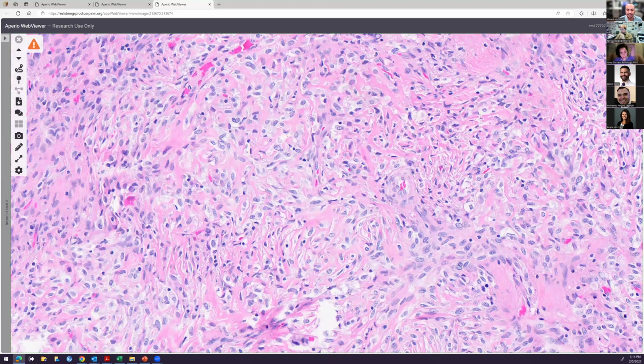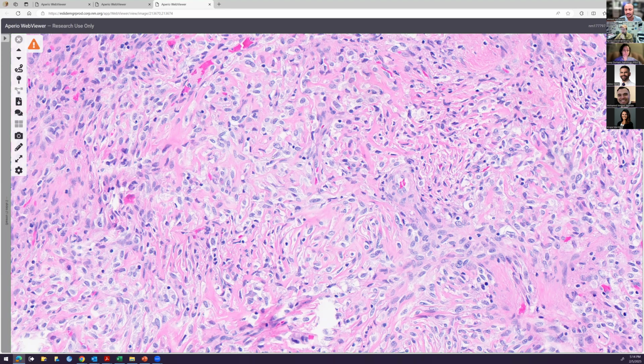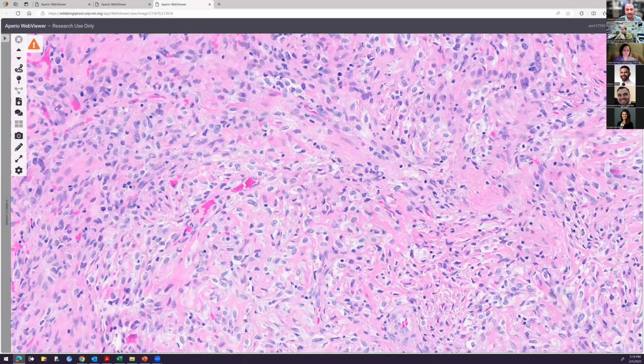They have this clear cytoplasm, but they also seem like they're matrix producing with this eosinophilic sclerotic area around them. Yeah, exactly. So they're kind of round, maybe epithelioid, with this sort of clearing to them, but they are producing a fair amount of intervening sclerosis, right? So that's pretty typical. Okay.